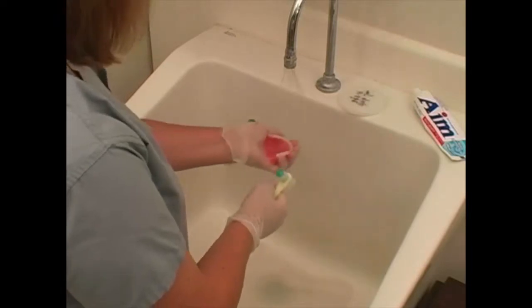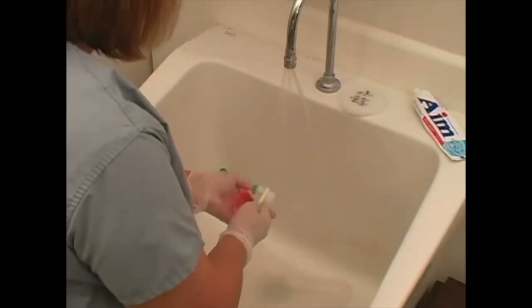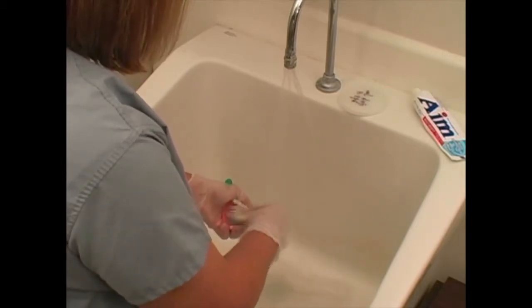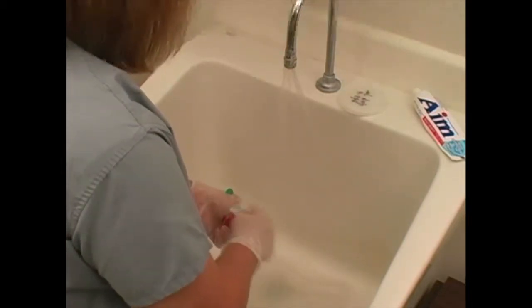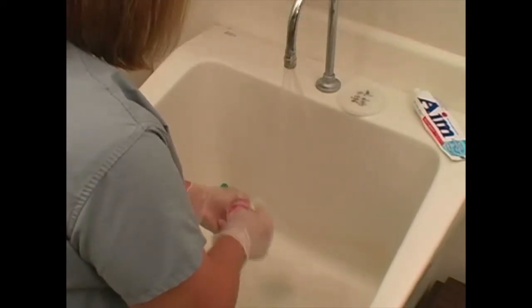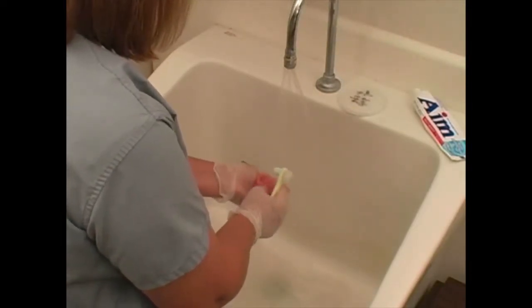Rinse each denture under cool running water. Use toothpaste or denture cleanser to clean the dentures. With dentures in your hand, brush all surfaces until they are clean. Rinse dentures thoroughly under cool running water.